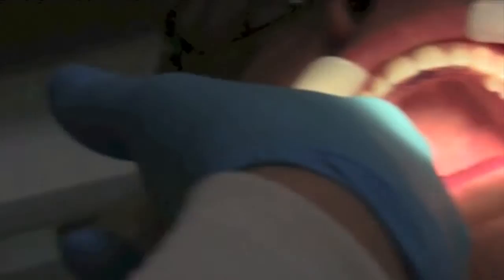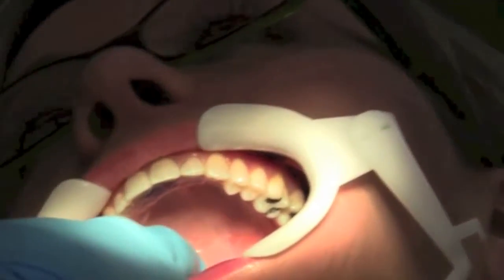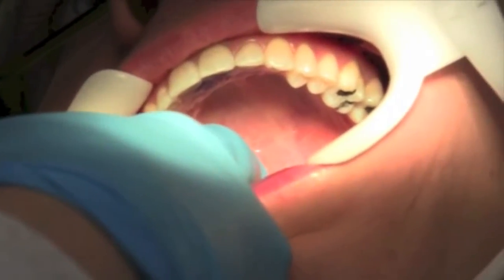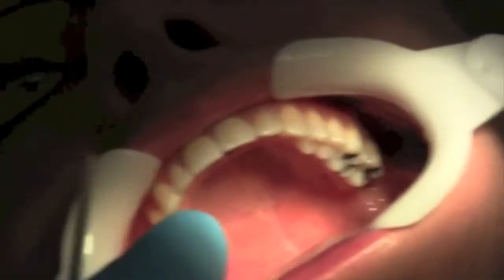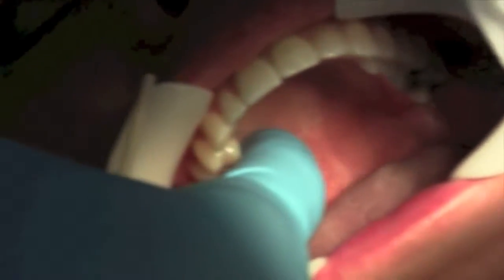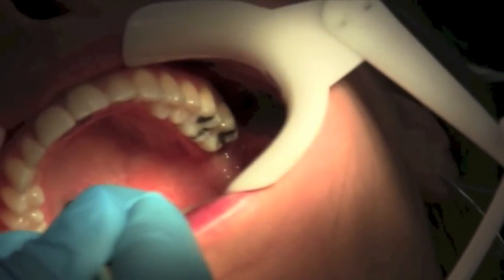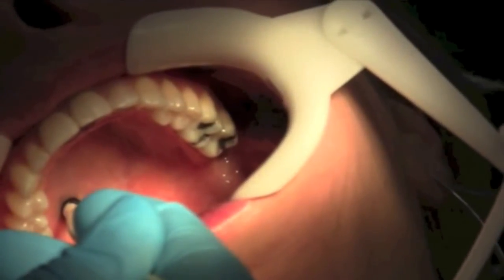In finding, you would take your finger palatal to the 7 and you are feeling for sponginess underneath your fingertip in the area. You would find, dry, and apply.